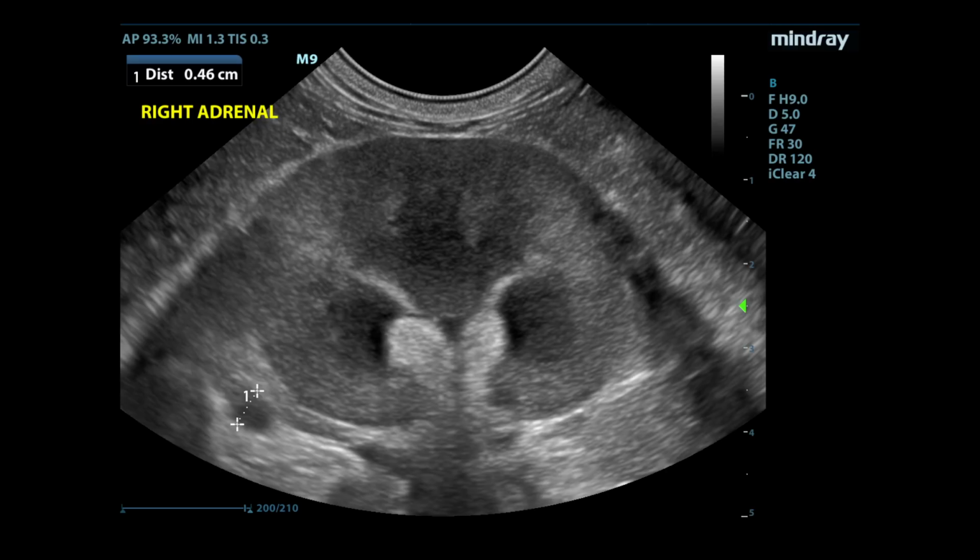In cats, adrenal width should be from 0.4 to 0.46 centimeters, or 4 to 4.6 millimeters. Borderline measurements are probably normal. Note the dilated renal pelvis in the right kidney of this cat.